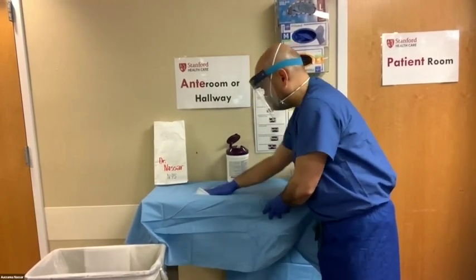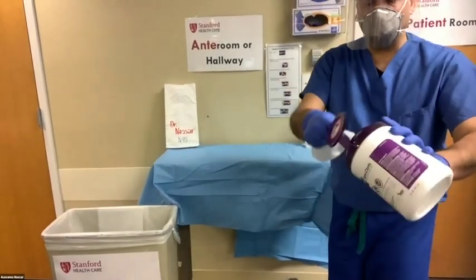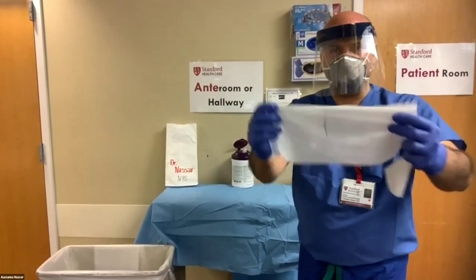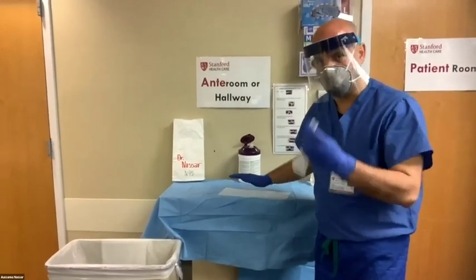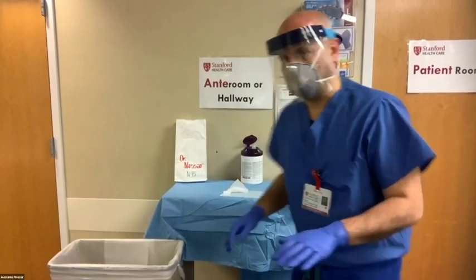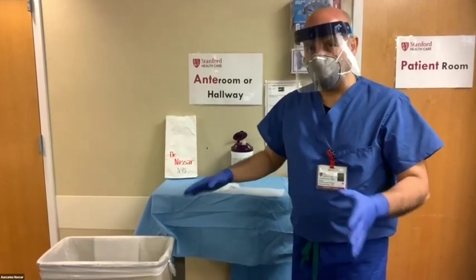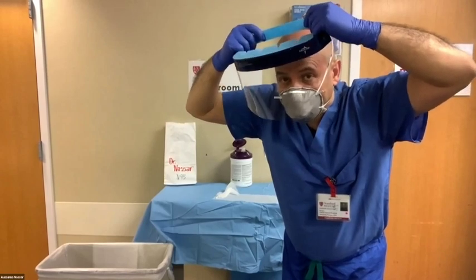Once you clean the area, doff the face shield. Using the sniffing position, remove the face shield as previously described, making sure not to touch your face. For an efficient technique: take three wipe sheets — place two sheets down as a clean landing zone for the face shield, and hold one in your hand. Then remove the face shield and rest it on the two sheets.